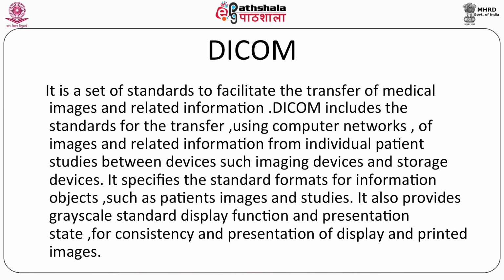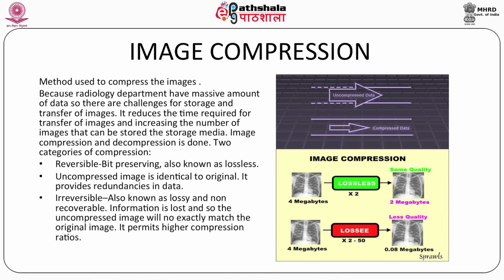It also specifies the standard formats for information objects such as patient images and studies. It also provides a grayscale standard display function and presentation state for consistency of presentation of displayed and printed images.